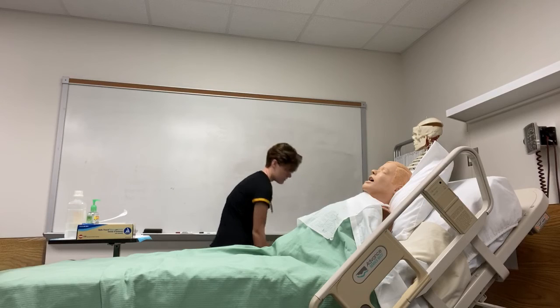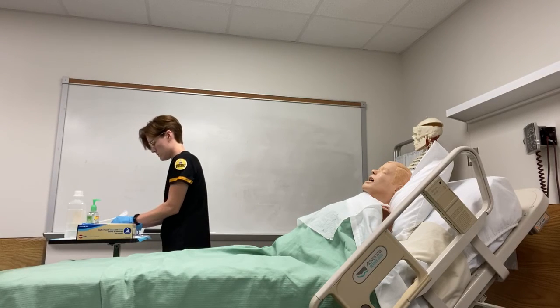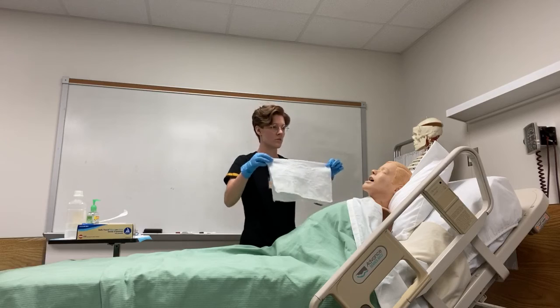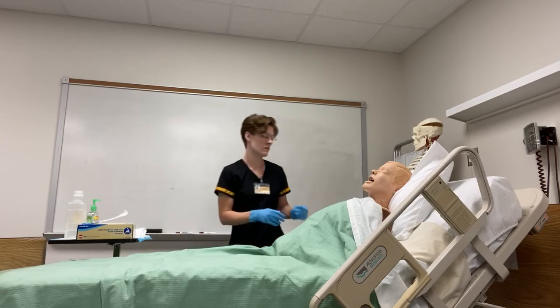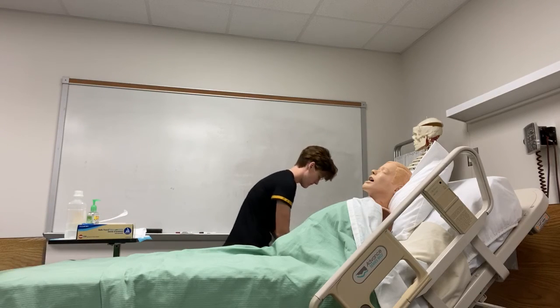Now just discard the tubing. Alright. Are you experiencing any pain or anything? No, I'm fine. Alright, so your nostrils feel good, you can breathe out of them well? Yeah. Okay, so the patient's doing good. Is there anything you need me to help you with before I do leave? No, I don't think so.